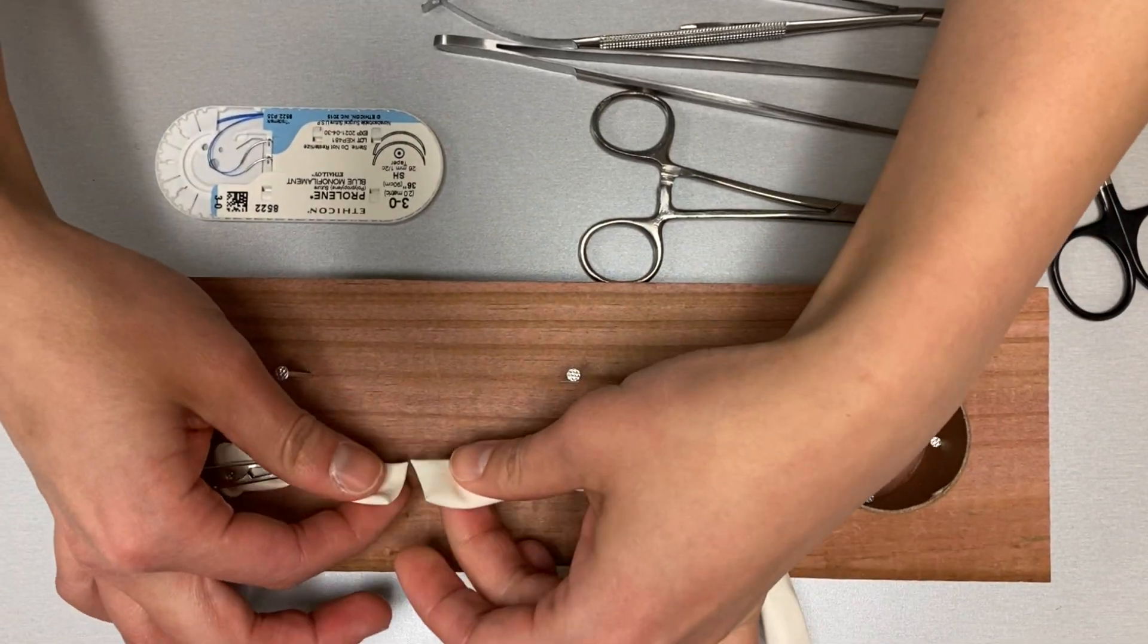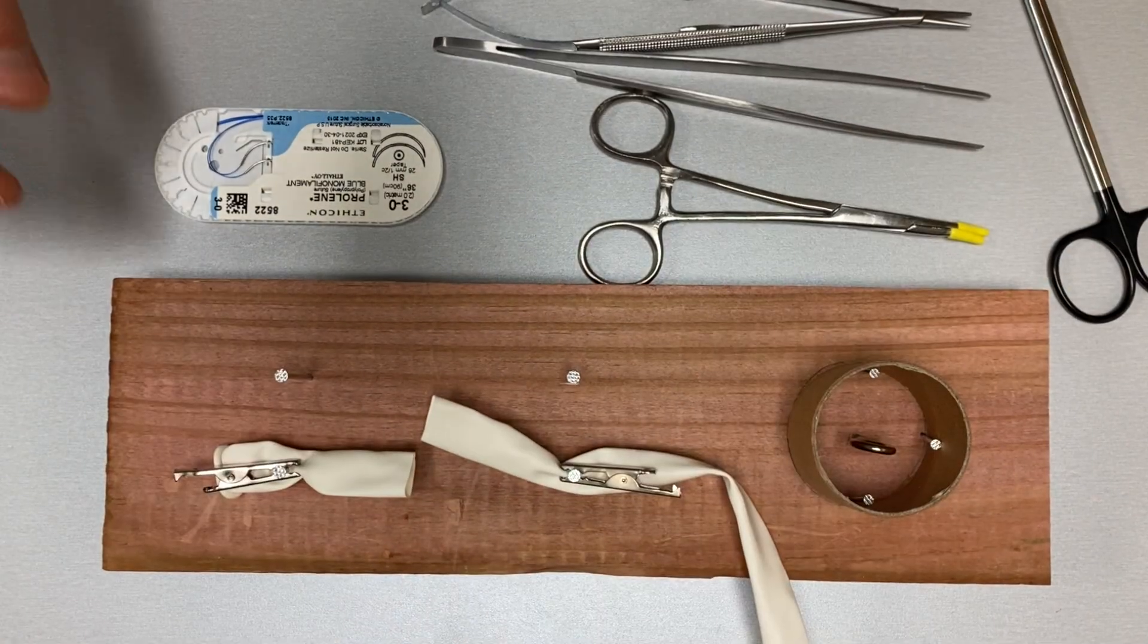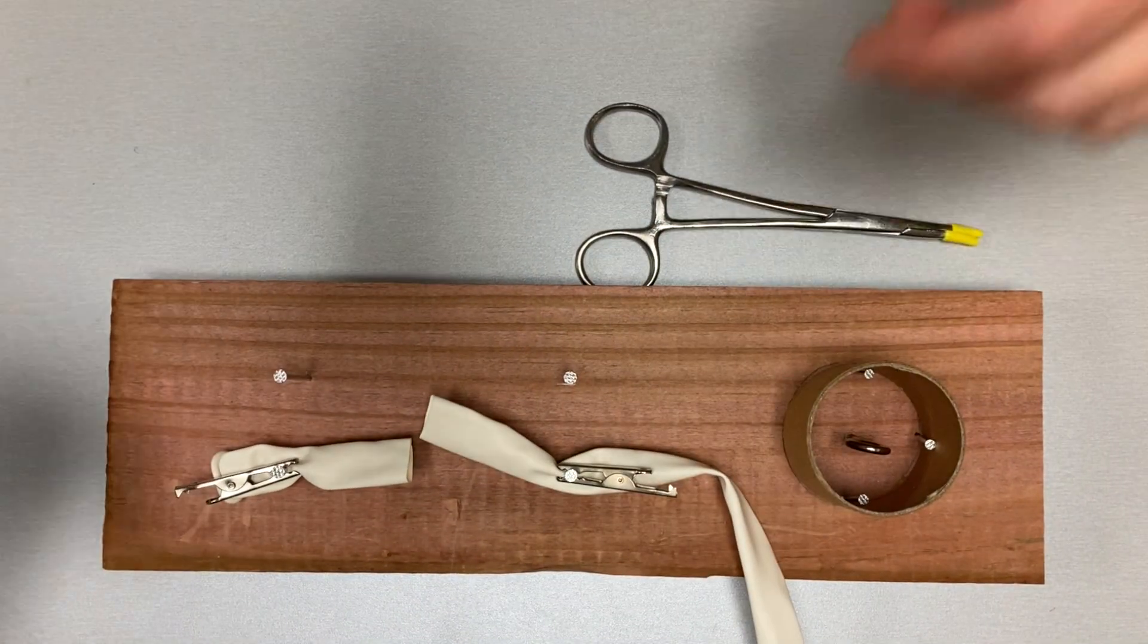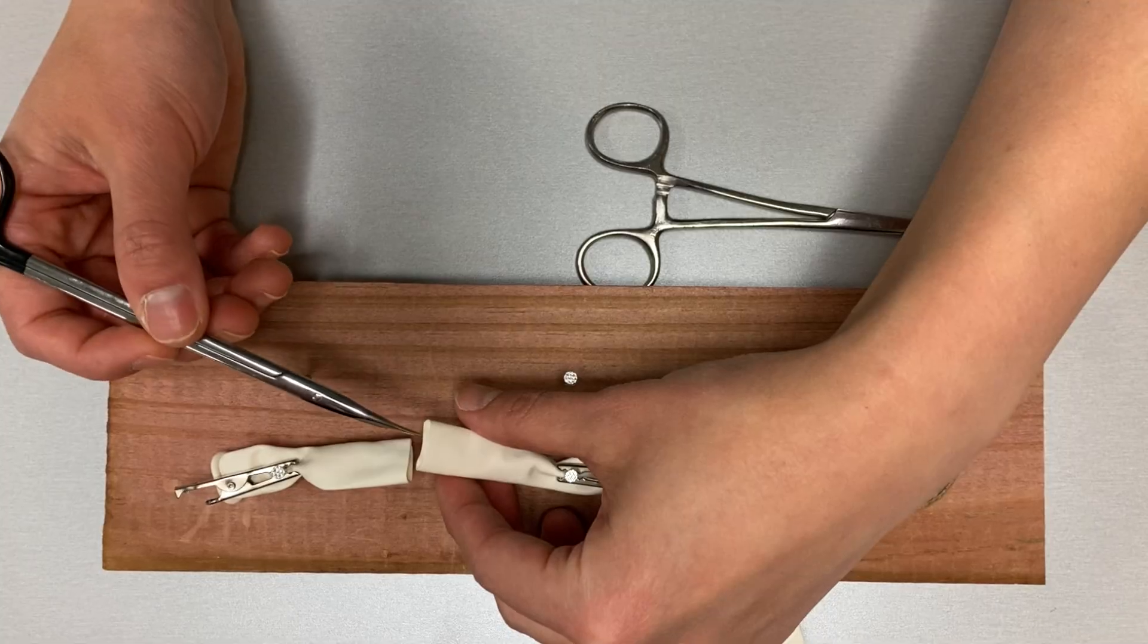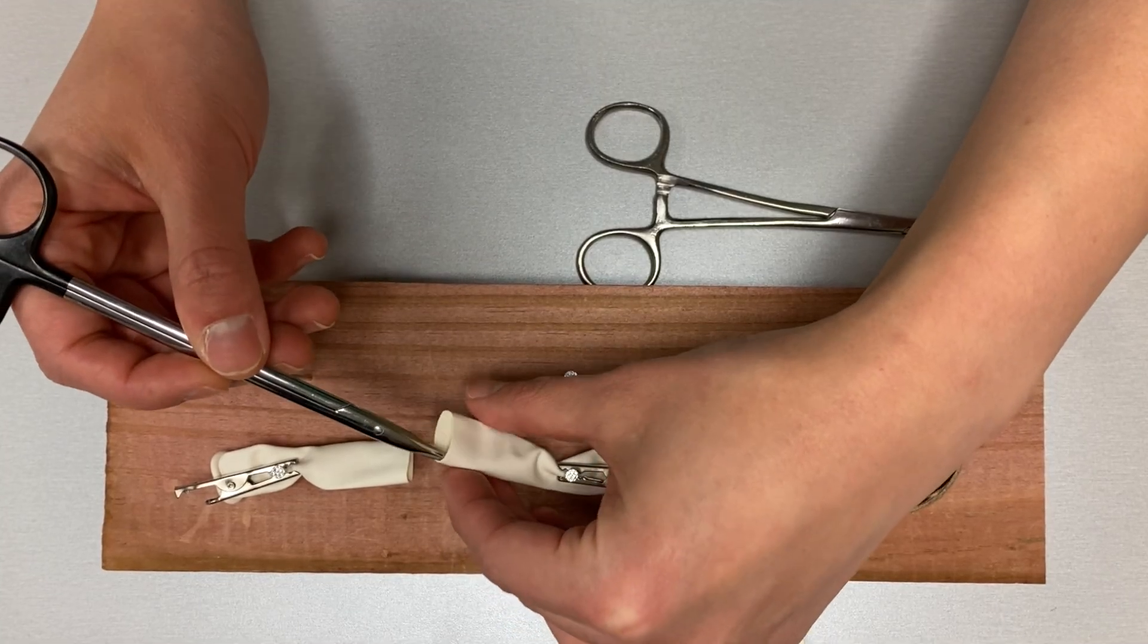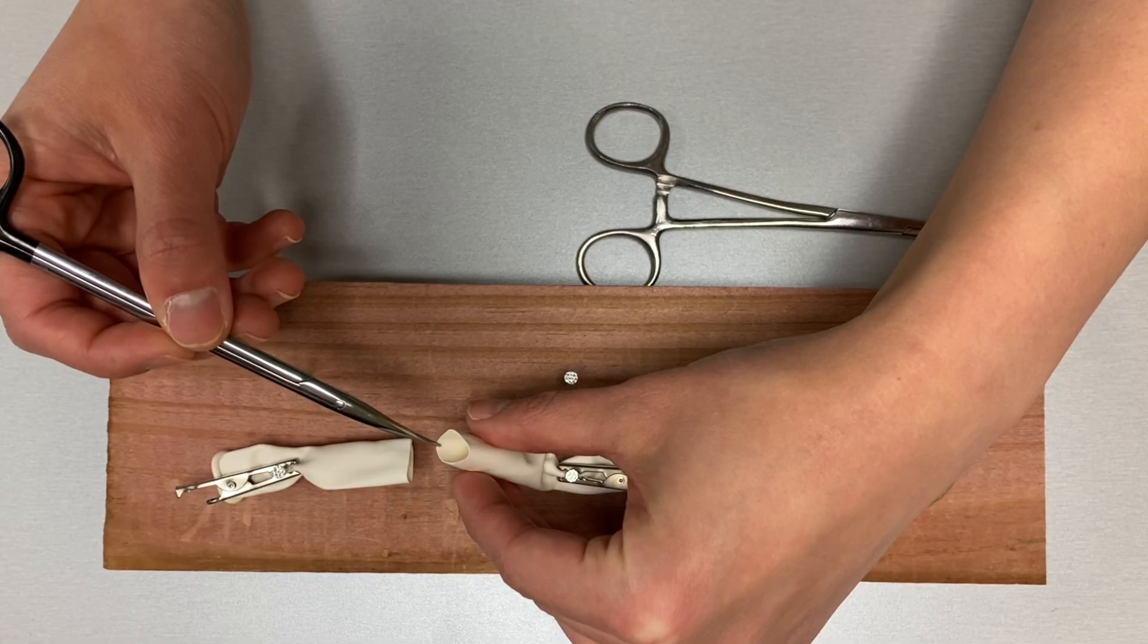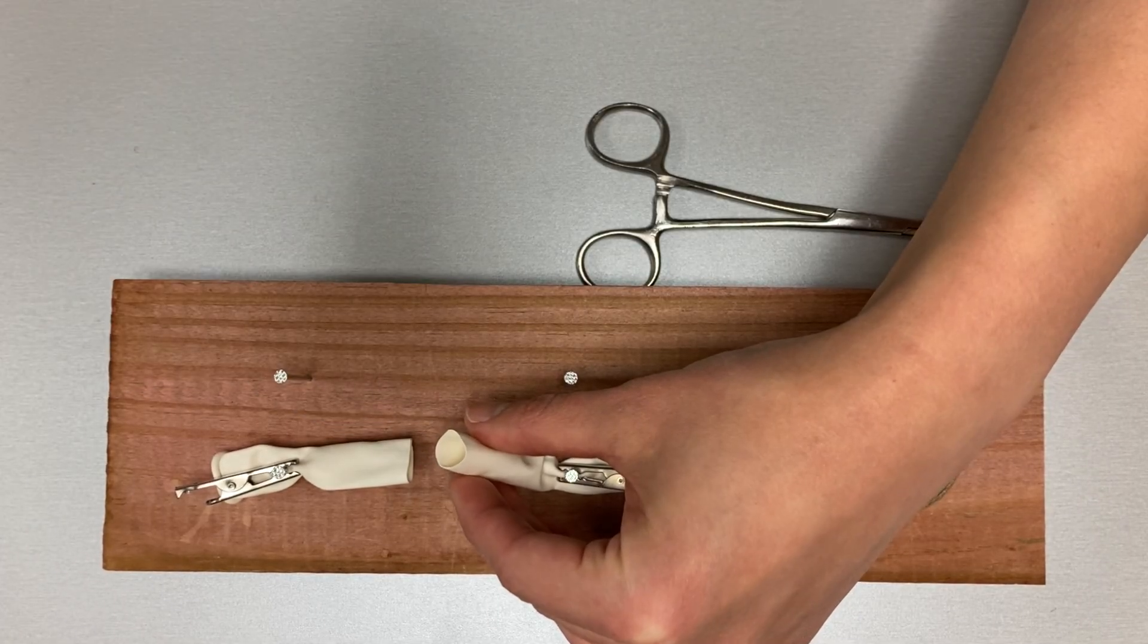The balloon ends may stick together, so you may need to roll them in your fingers to loosen them. It is helpful to envision a clock face when approaching the anastomosis. Shown here is 12 o'clock, 6 o'clock, 9 o'clock, and 3 o'clock.